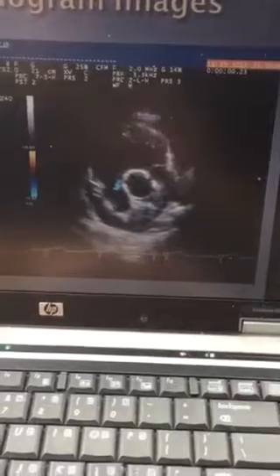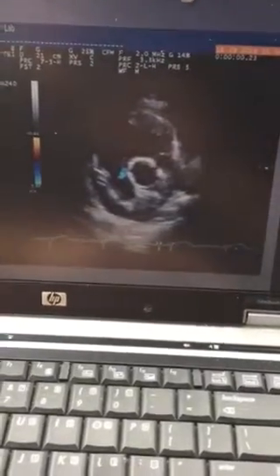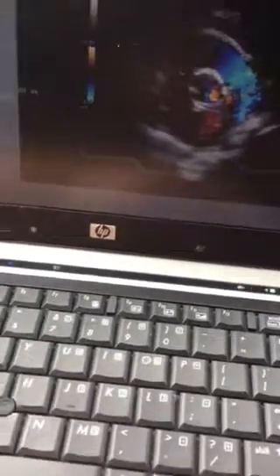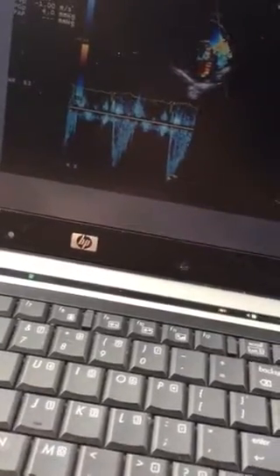Putting color on the aortic valve shows that there's no insufficiency. We did see a trace pulmonary insufficiency that was on the report, but I think it looks a little more than that. I think it looks mild when you look at the videos. A continuous wave was not taken on the PI jet, but it definitely should have been. Peak pulmonary velocity was 1.0 meters per second, which means the pressure gradient was 4 millimeters of mercury. That is all still within normal range.